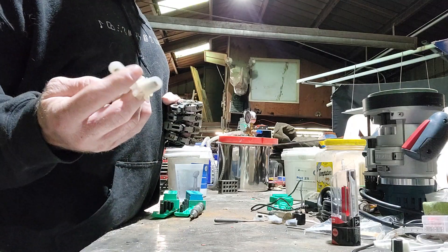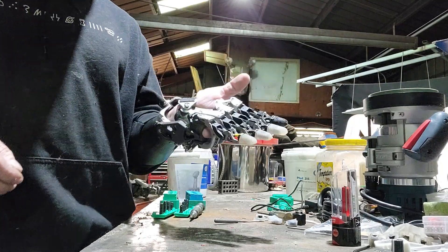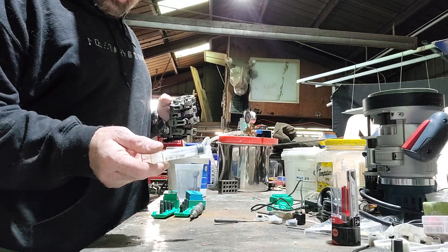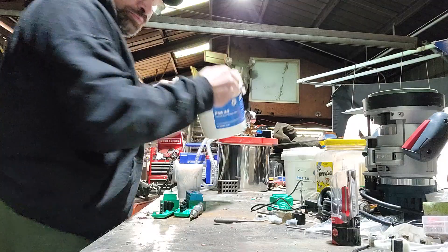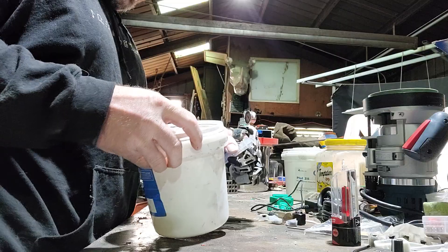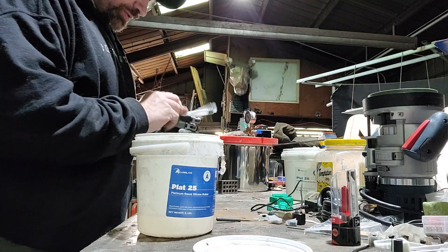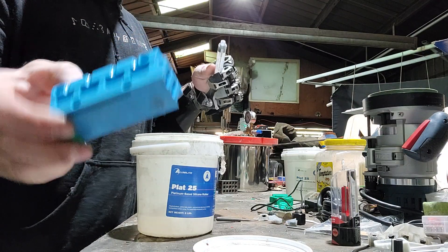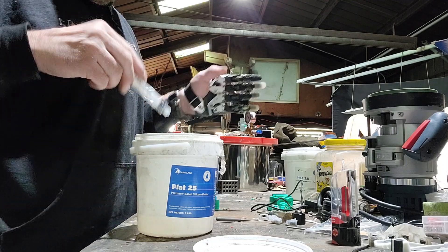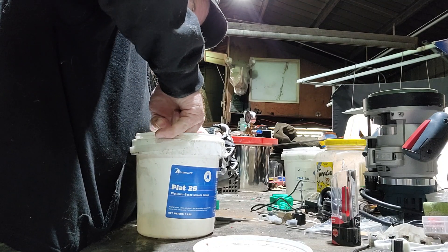Today I'm making fingertips for a guy in Dallas who's making himself a hand. I'll show you how I do it. I use two syringes, one marked A and one marked B for the A and B silicone. I figured out that two draws of each syringe will fill up these cavities and give me just a little bit of leftover in the bottom of the cup.